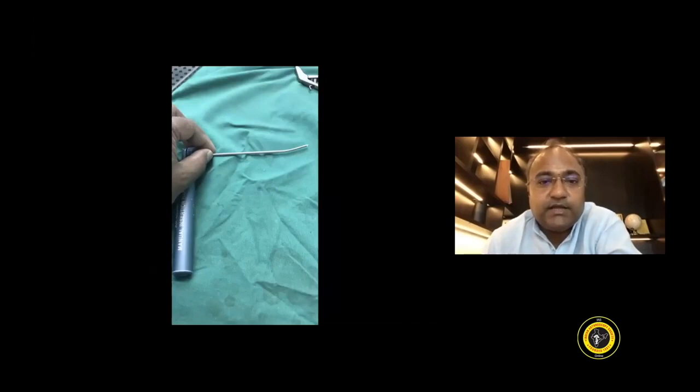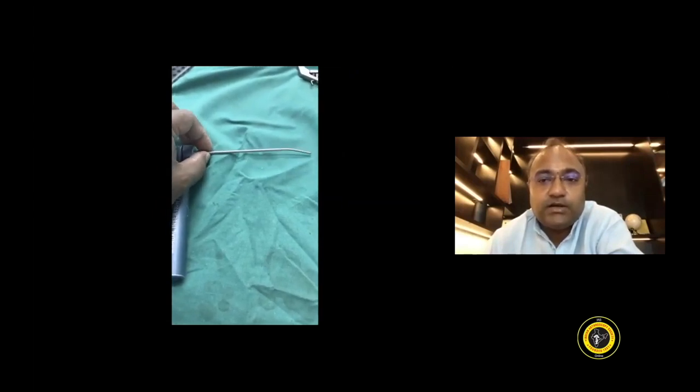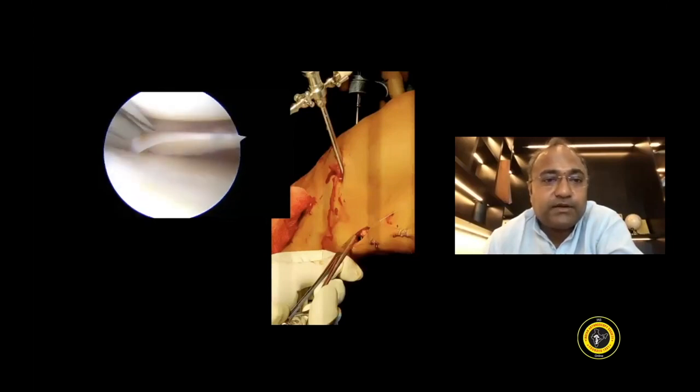With this understanding, another tip is to use low profile cannulas, which can be turned 180 degrees. So you can go on to the meniscal surface and to the undersurface of the capsule by turning the cannula. This is the video of the patient. You have taken stitches on top of the meniscus in a vertical mattress fashion, as you can see, and now you're coming on the undersurface.